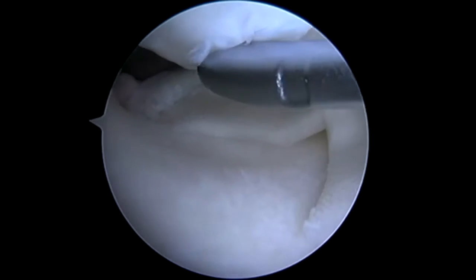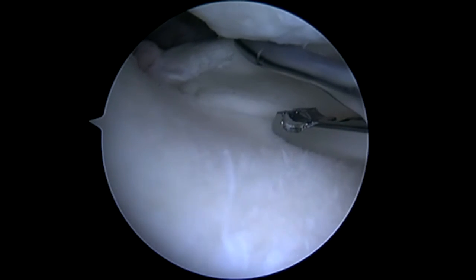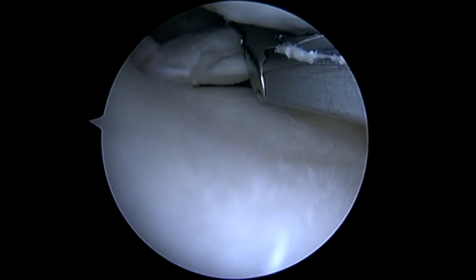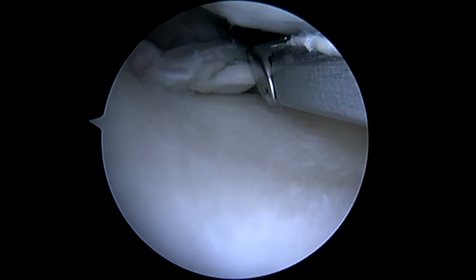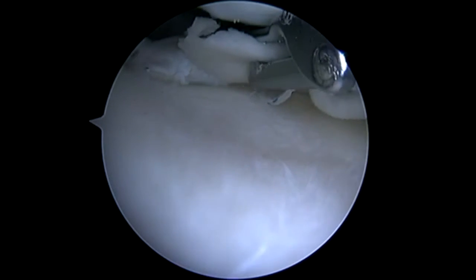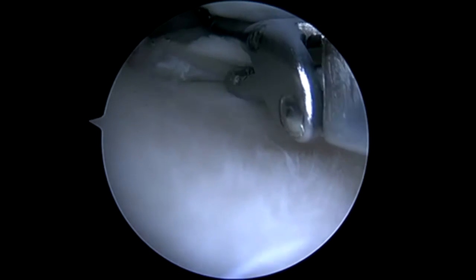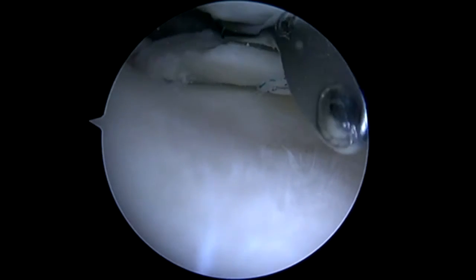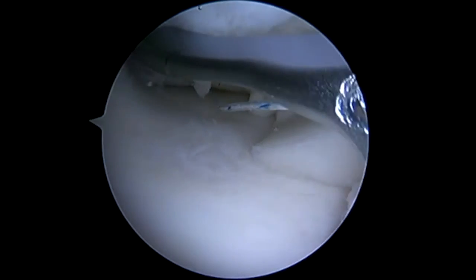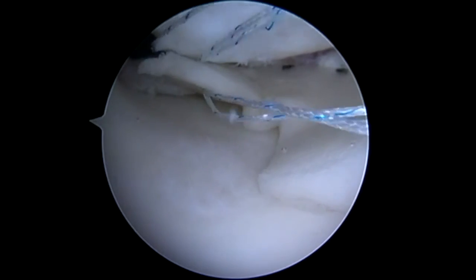Here I am using a NovoStitch Plus for this posterior horn to allow me to get a better angle, as I don't want to have a meniscal implant sitting out the backside of the meniscus in an intra-articular position. I'll go ahead and pass over, get around that posterior horn, and then pass through the implant. I encourage you to exert caution utilizing this device for this implant, as the NovoStitch has higher traction on the sutures and could lead to cut-out of the CMI implant. It is possible, but you have to be technically excellent with the device.